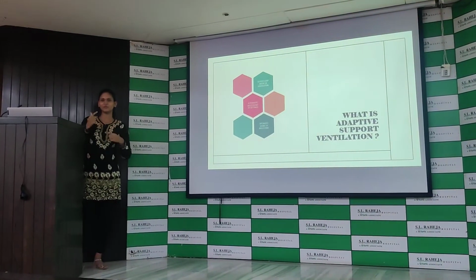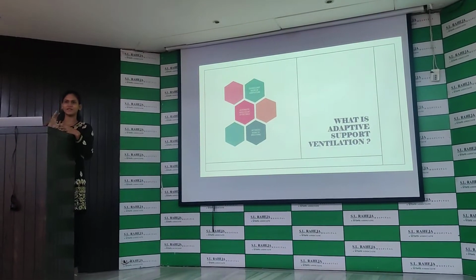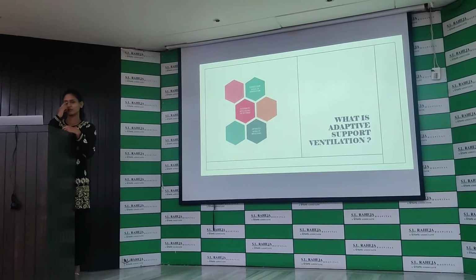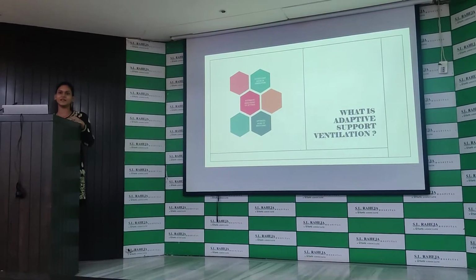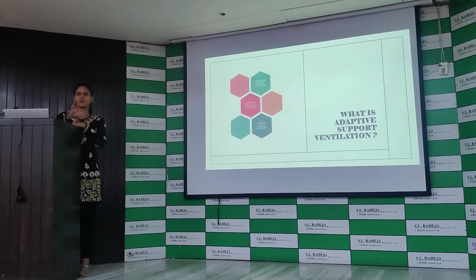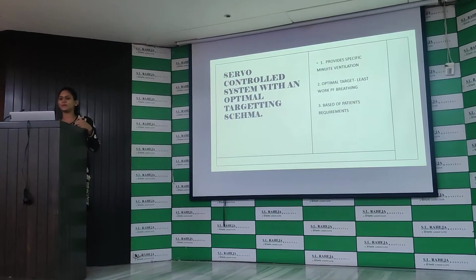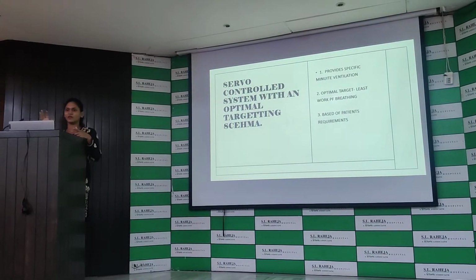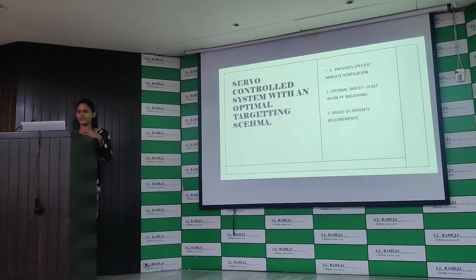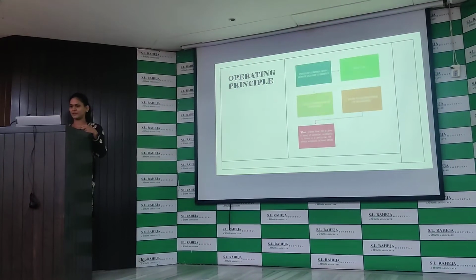Okay? So this occurs from breath to breath in ASV. There is automatic adjustment of settings according to this closed loop mechanism, and it optimizes the work of breathing. The entire principle is to minimize the work of breathing. That is what we are concerned about. It does so by providing a specific minute ventilation target, to have the least possible work of breathing, based on the patient's requirement through the closed loop mechanism.